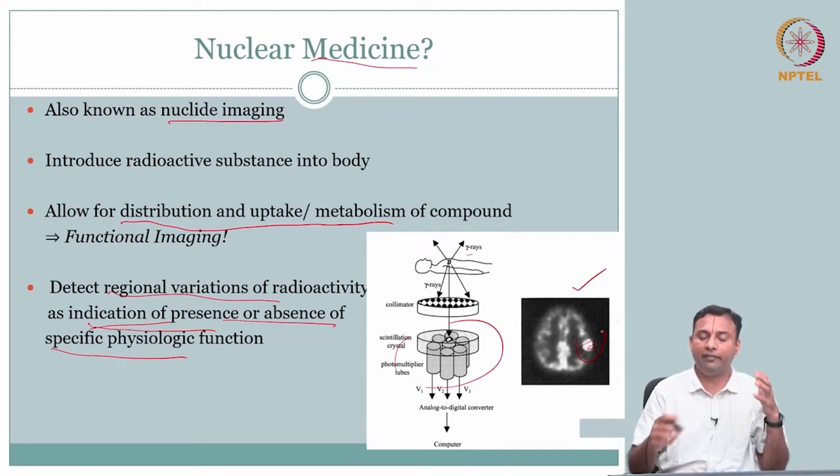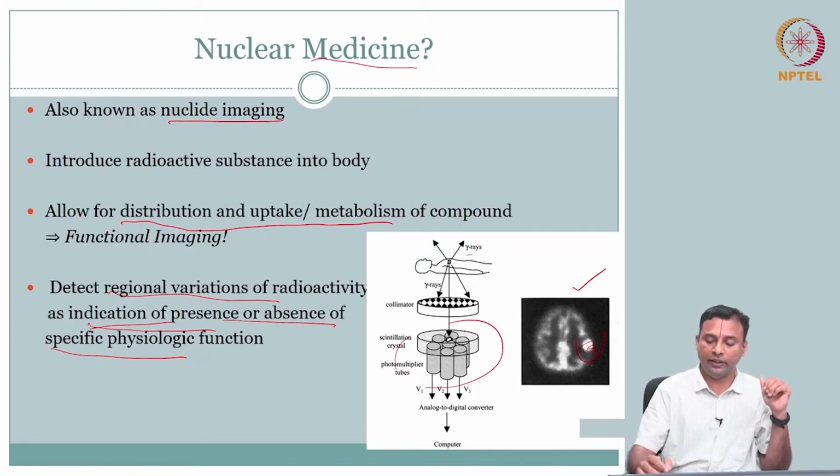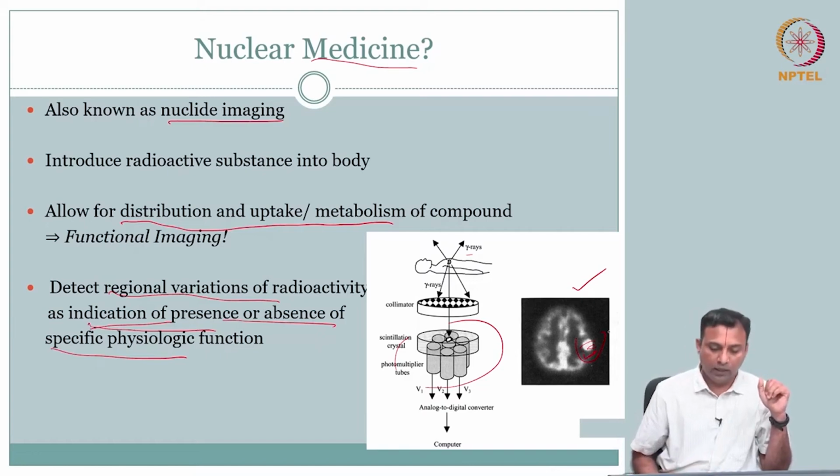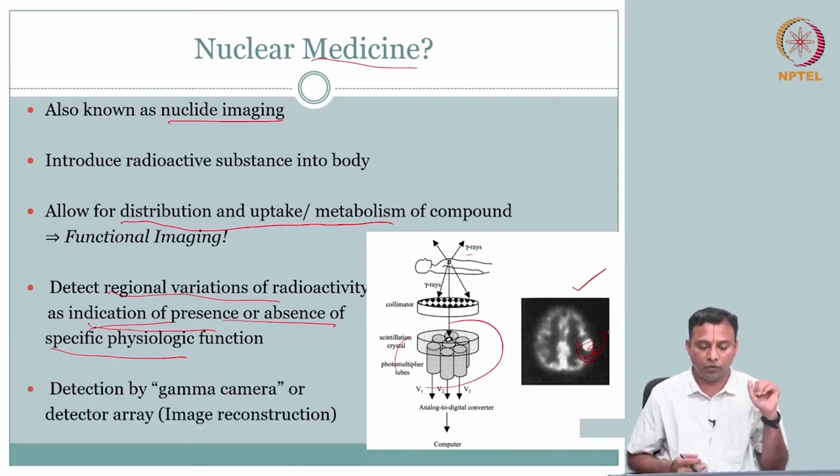So the radioactivity will come more from this location, because the radiotracer that you sent is supposed to go there. Okay, so you engineer it so that it goes to that location. Good. So we'll go into all these terms that I said: radioactivity, tracer, giving out energy, gamma rays, detector. All this we will cover. But this is the rough idea that we want to know.